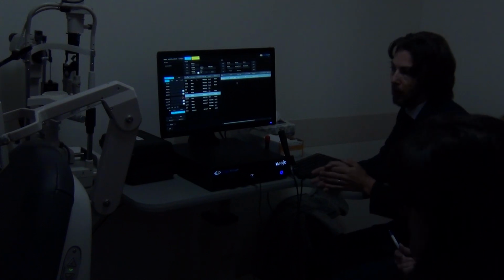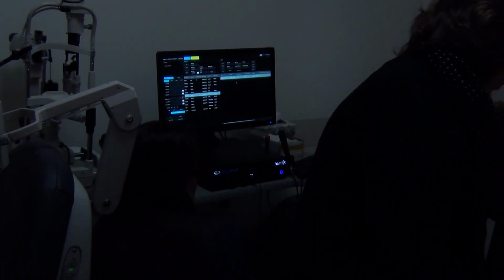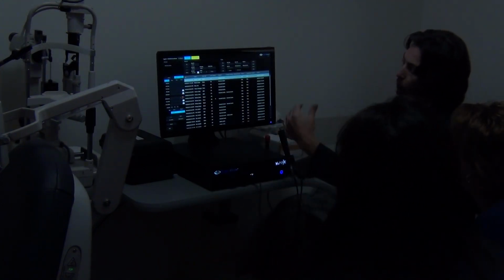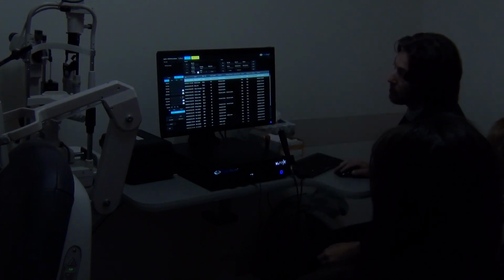If, for example, a doctor says, listen, I would like to see all my UBMs, right? It doesn't matter which patient it is, I just want to see the UBM list. You go by exams. So now all patient data is brought up by the exam. And if you click on exam type right here, you can always highlight them.